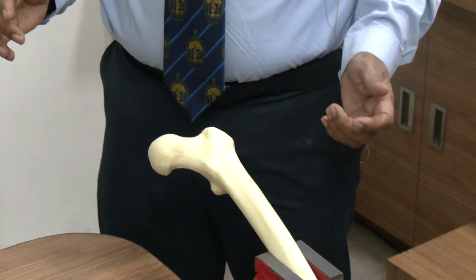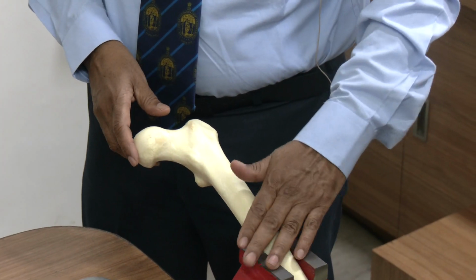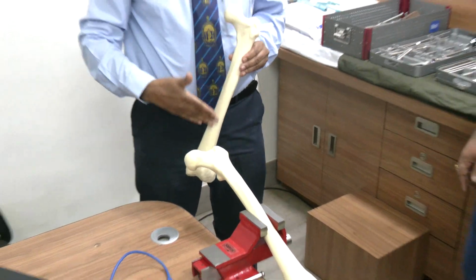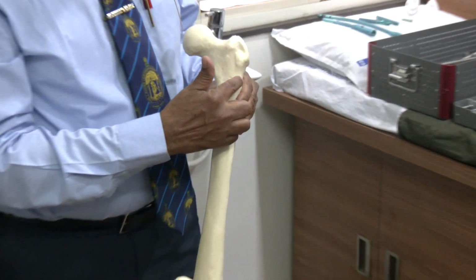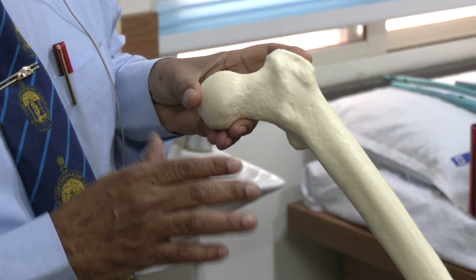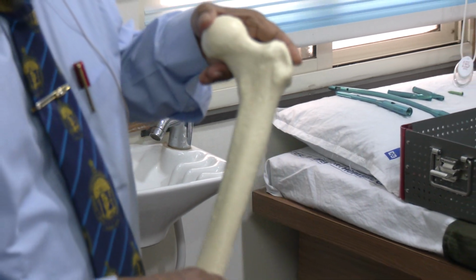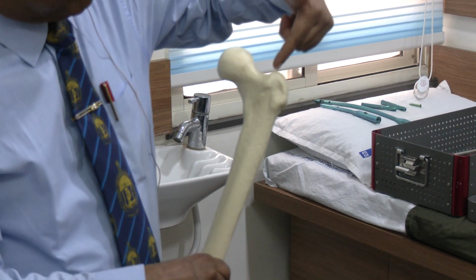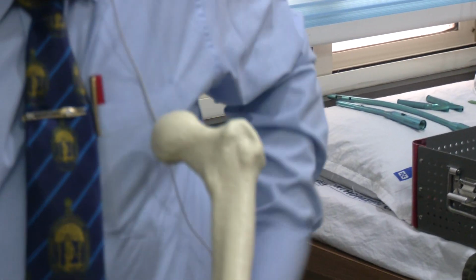What we normally do, I'll just show in another bone because I don't want to take this out and waste our time. See, this is the fracture. Once we fix it, many times the fracture gets reduced in abduction. Once I have fixed the fracture with K-wires, I can adduct it. The more adduction I do, the easier it will be for the surgeon to put the nail, because if the limb is abducted, the pelvis comes in the way.